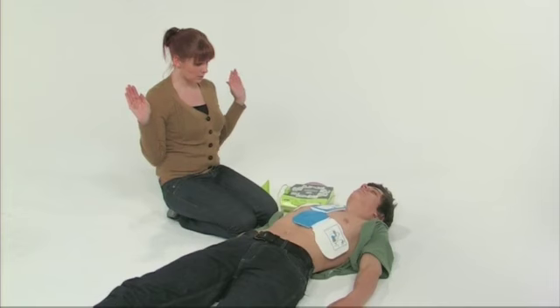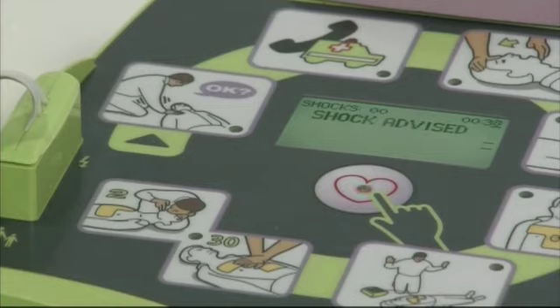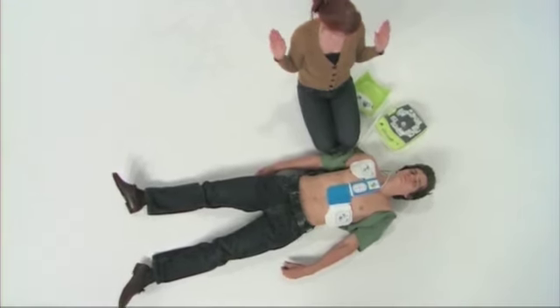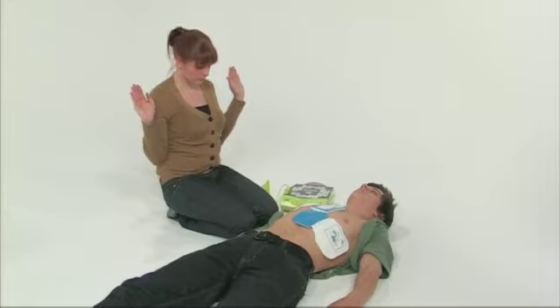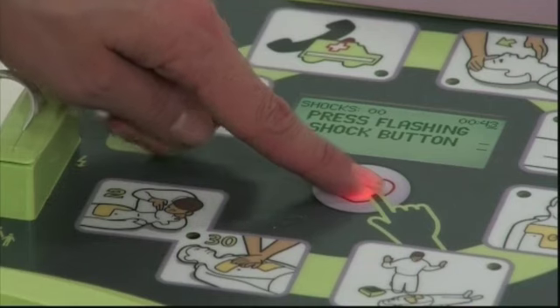The AED Plus will determine whether or not the patient can be treated using defibrillation. If they can, the AED Plus will announce shock advised. It will then warn you not to touch the patient and to press the flashing shock button. Maintain a safe distance from the patient and ensure that neither you nor anyone else is touching the patient before you press the shock button.